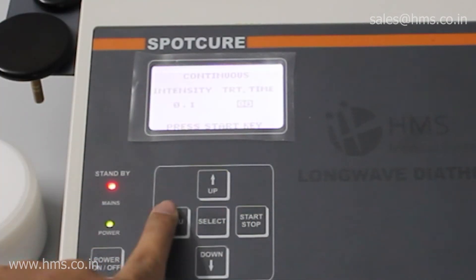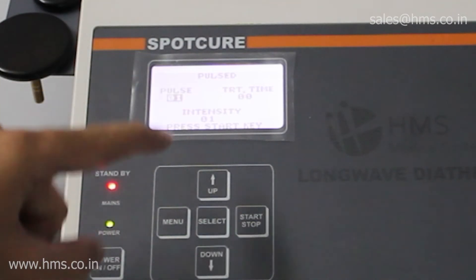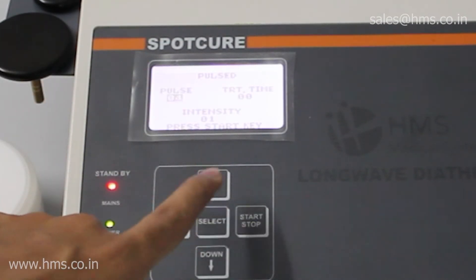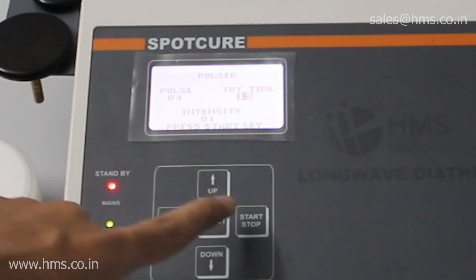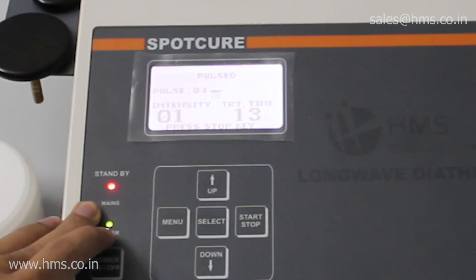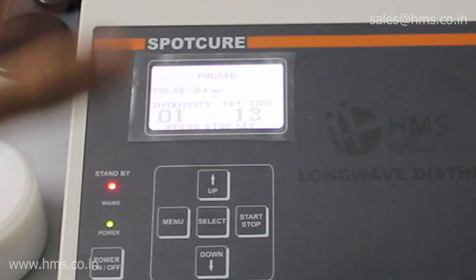Operating the pulsed mode is also very simple. Go to pulse mode and here you can set the number of pulses you require. After setting the pulses, you can set the treatment time — you can set a maximum of 99 minutes. After setting all your parameters, just press the start button. The treatment will begin, just like in continuous mode, and it's very easy to use.